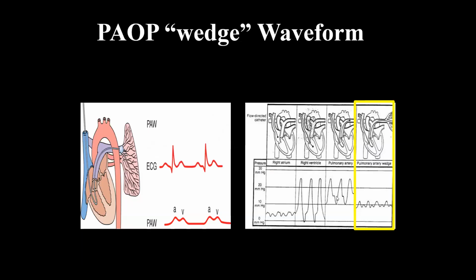So if you look at the pulmonary artery, I inflate the balloon here. I inflate the balloon and it flattens out. Do you see that? And that's a wedge pressure.